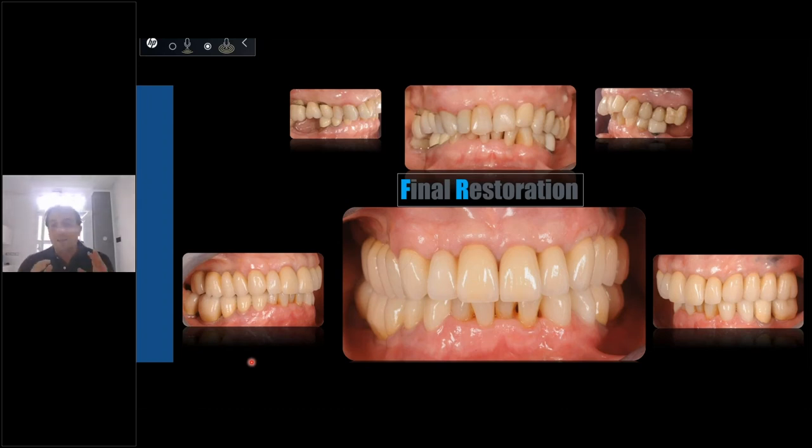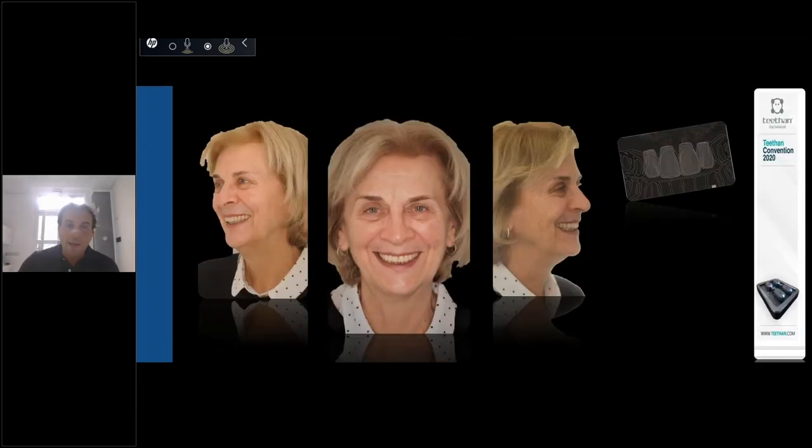Now I want to control the patient. I follow the patient every 4 months for the first year and every 6 months for the other years. And now this is the final restoration of the patient.